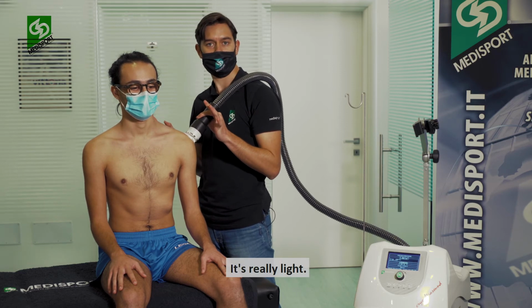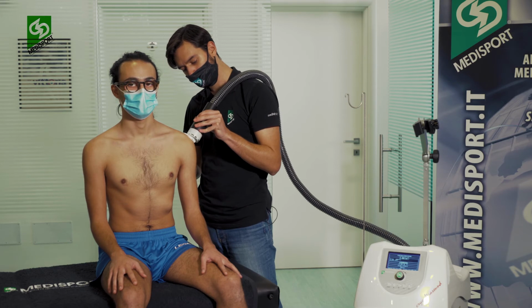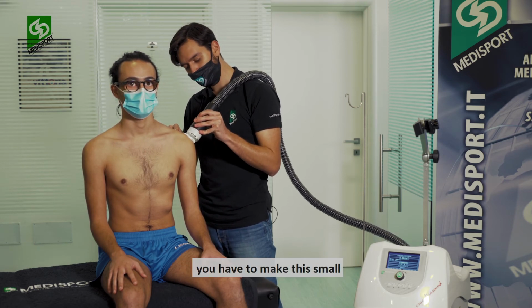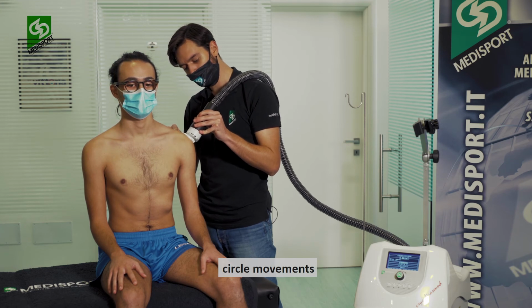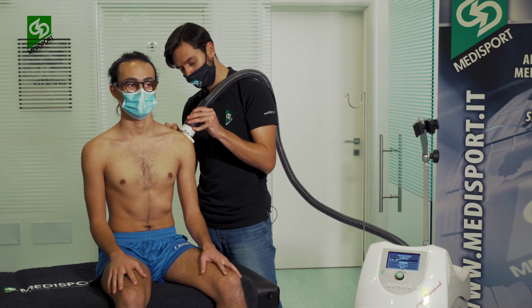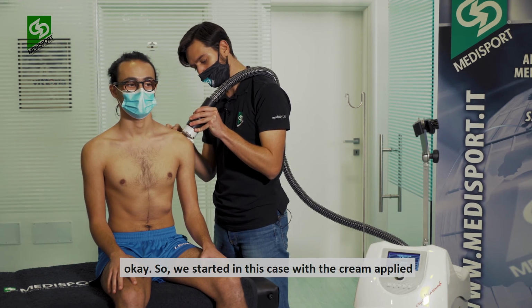It's really light. In this way, you really don't make any effort. In the application of the therapy, you have to make these small circle movements and very slow, because you want to penetrate. Okay, so we started in this case with the cream applied on the shoulder.